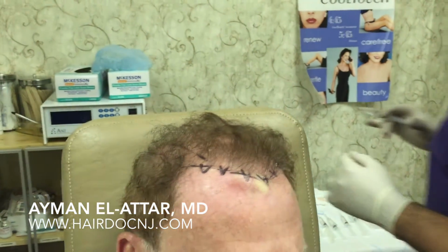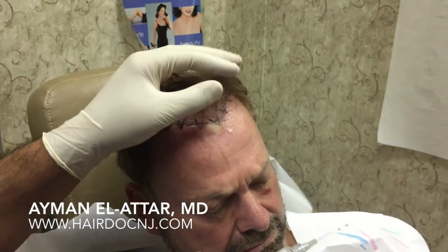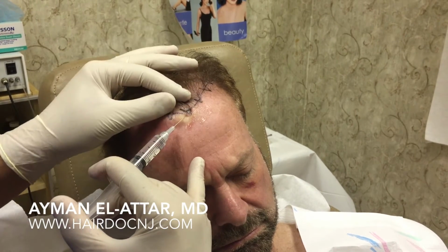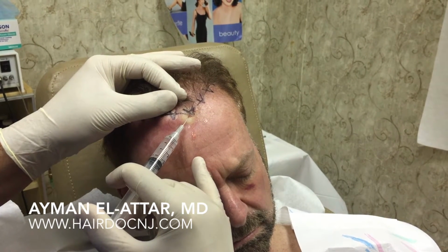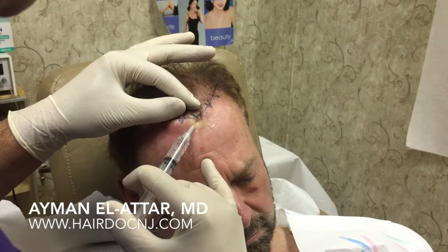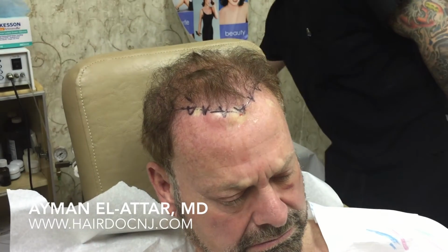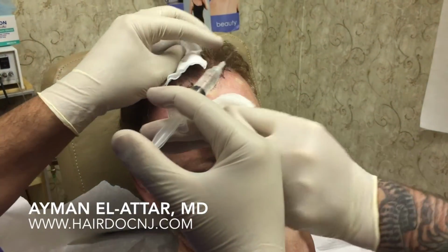We leave this area, we come from the other side, while that side numbs up. Usually it takes about 90 seconds for the lidocaine to have full effect of numbing, while epinephrine takes up to about 20 minutes to give you a full vasoconstrictive effect. So again, we let it proceed slowly. How you doing, Jeff? Oh, just fine. Don't feel a thing. That's a great patient. As we see, we're starting to see the vasoconstrictive effect of the epinephrine here.